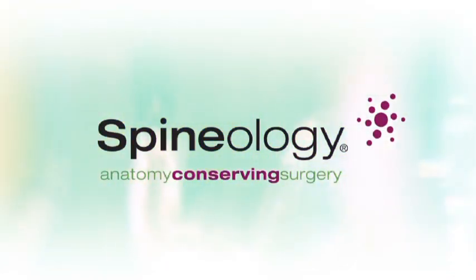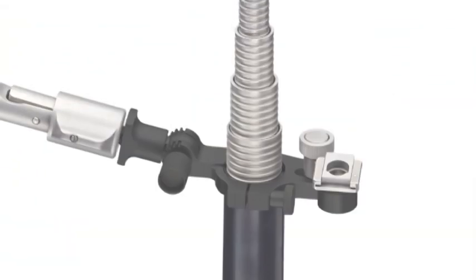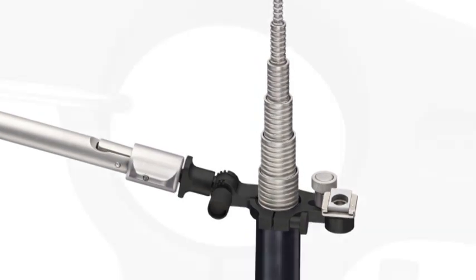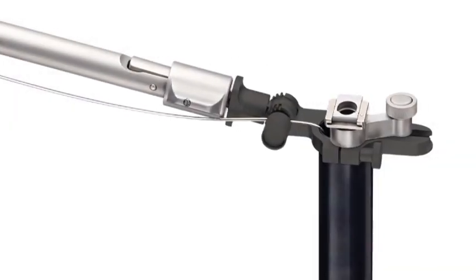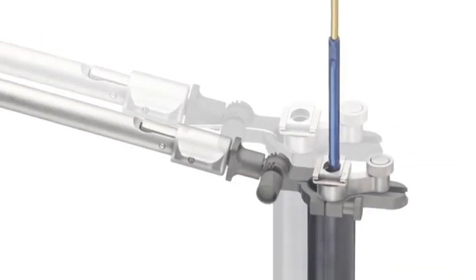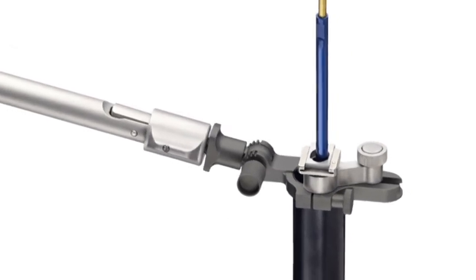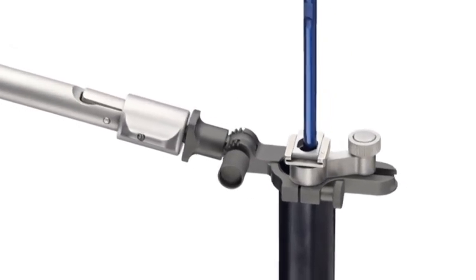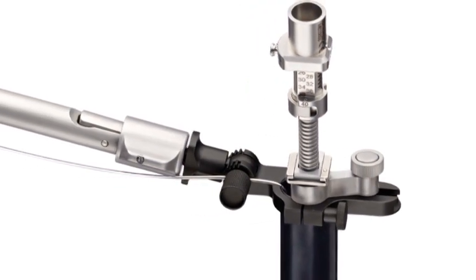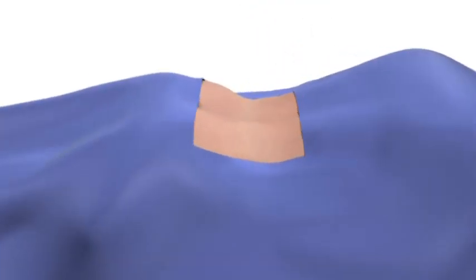Seamless integration, enhanced visualization, clinical confidence. The SOAR system is the first retractor to integrate neural retraction and articulating discectomy instruments with a tissue retractor system. By reducing neural retraction requirements and enhancing visualization, the SOAR system is designed to minimize neurologic risk while enabling decompression and discectomy for interbody fusion procedures.